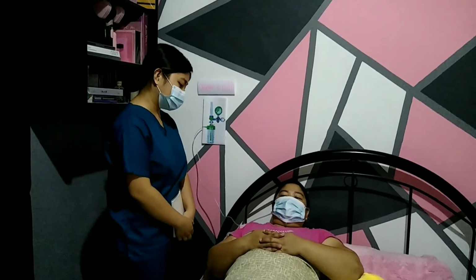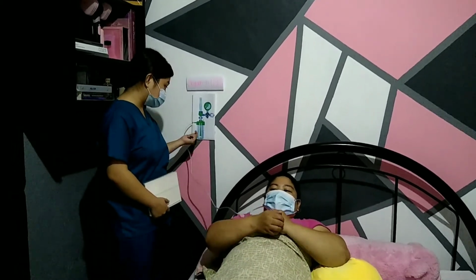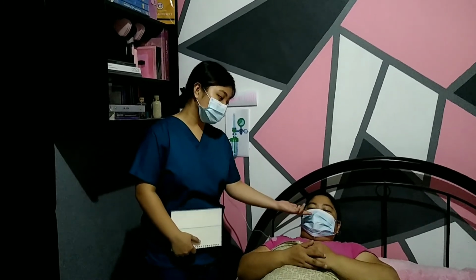And for the evaluation, you can now monitor your patient's response to changes in flow rate with SpO2. And then you can now observe the improvement of your patient in physical signs and symptoms. Okay? Observe. And then assess the adequacy of oxygen flow each shift. Don't forget the meter or the flow meter. And then don't forget to observe your patient's ears, nose, nares, and nasal mucous membranes for evidence of skin breakdown.